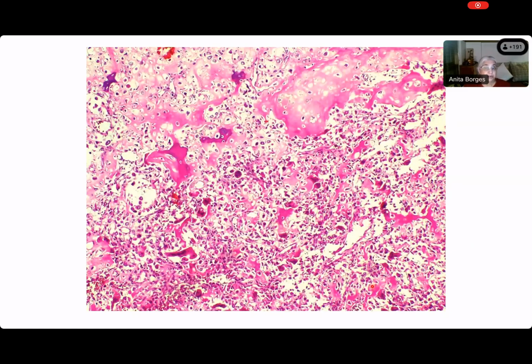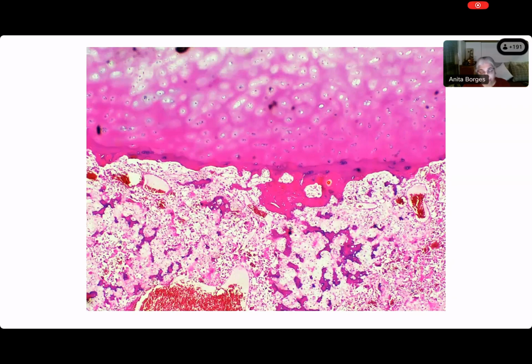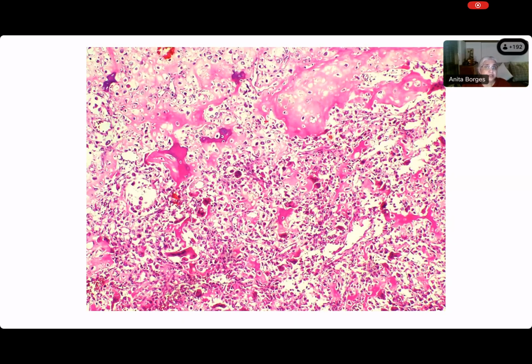What you saw there was looking more blue. Here it is looking quite pink. And that is the only reason it is doing that. Sarangi, when you described that needle core biopsy, you recognized those cells as being cartilage. Why? Due to chondrocytes. Yes, but why did you recognize them as chondrocytes? They have a halo around them. Yes, clear halos, and they were sitting in that blue extracellular matrix. Here, the matrix has turned pink, but we know this is probably blue. My normal cartilage, which would be blue, is now showing up as pink. So all this pink stuff over here is probably blue, because it has got halos around the cells that are within it.